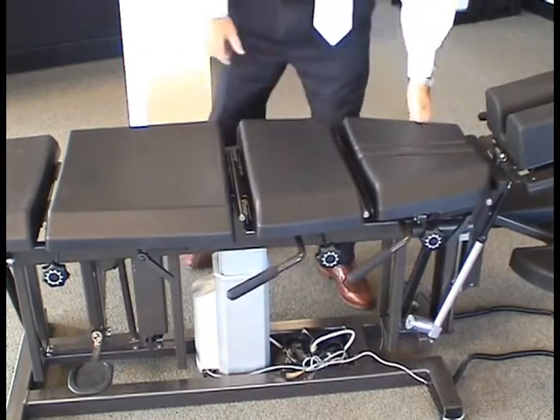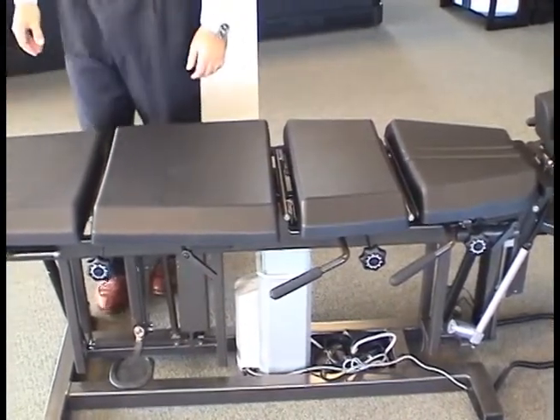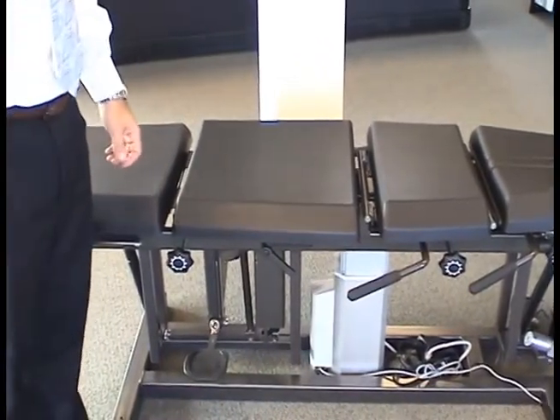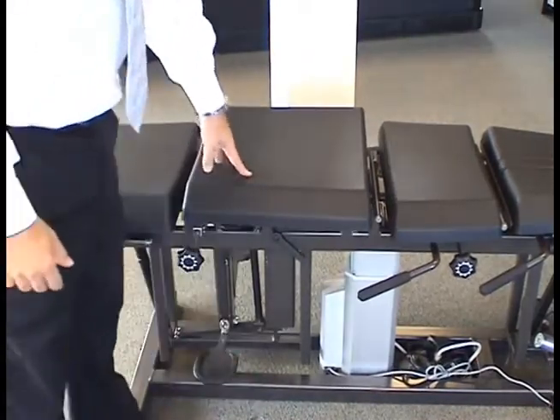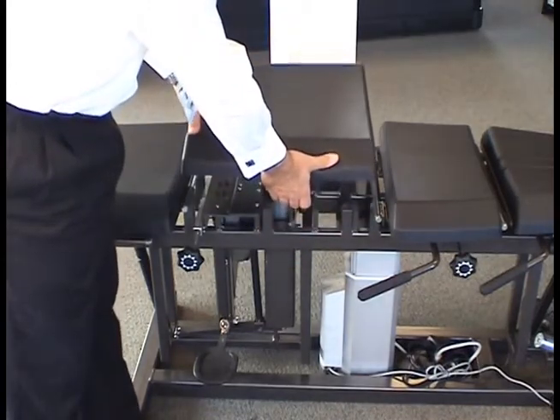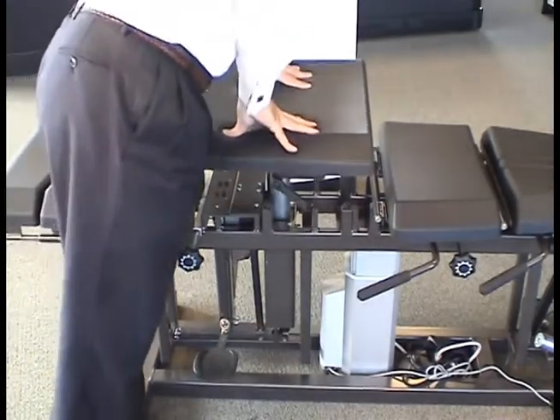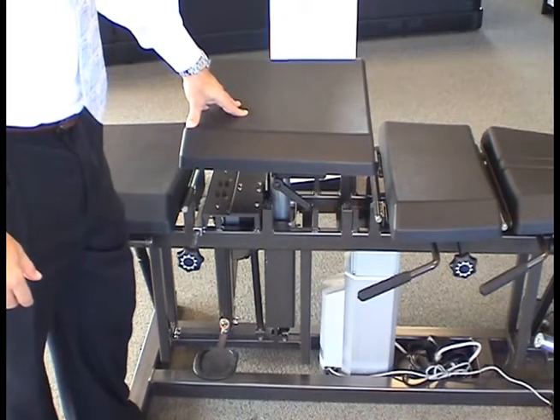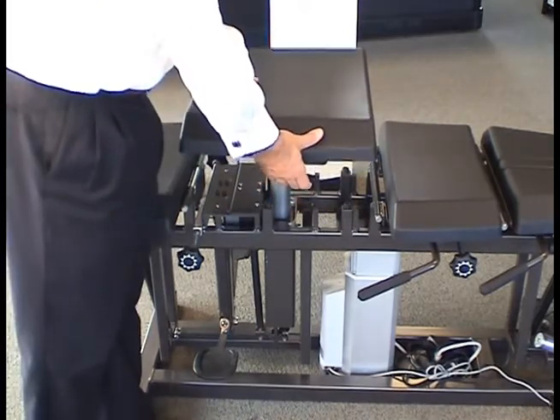Using the pelvic piece. If your table is equipped with the standard pelvic hinged drop, it is either cocked with a standard handle cocking device or optional foot cocking device. If your table is equipped with the optional pelvic elevation, it will come with a foot cocking device only and can be cocked and dropped in any position. The manually operated optional pelvic elevation piece elevates approximately 8¼ inches above horizontal.